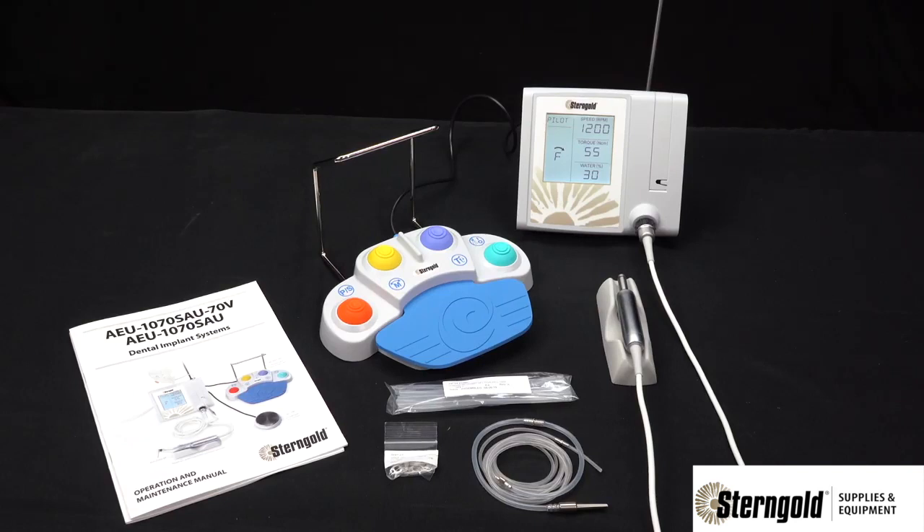Introducing the Sterngold AEU-1070SAU-70V implant motor system.